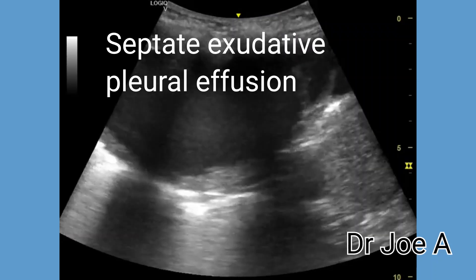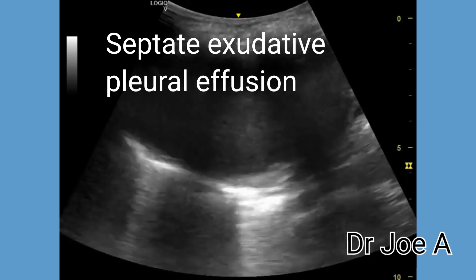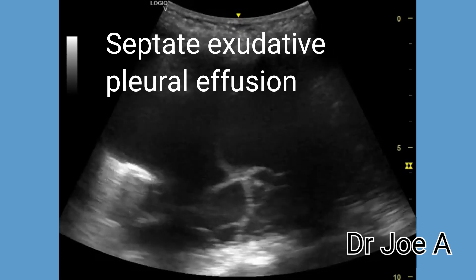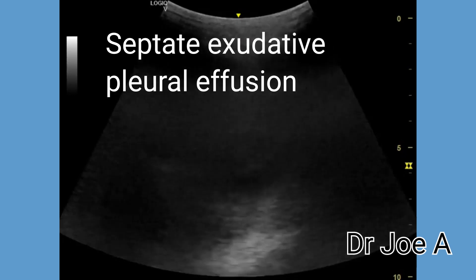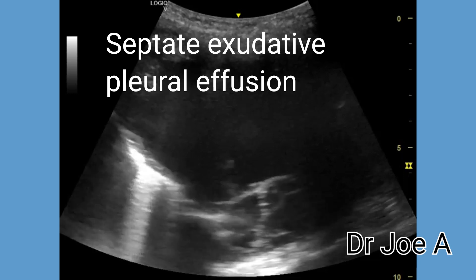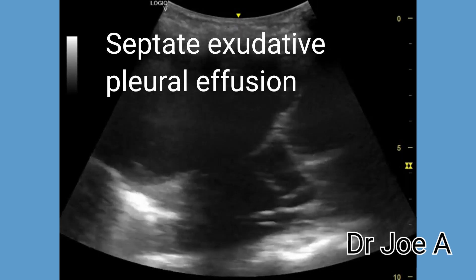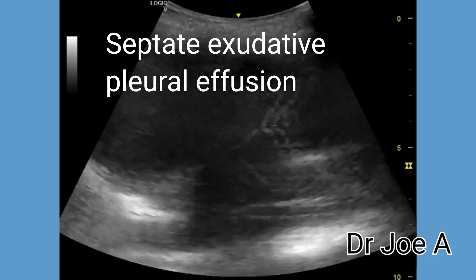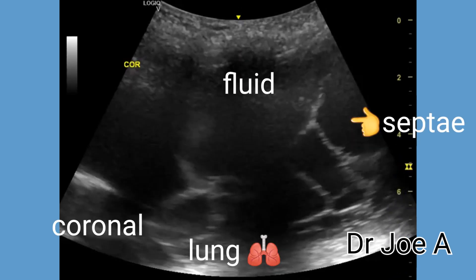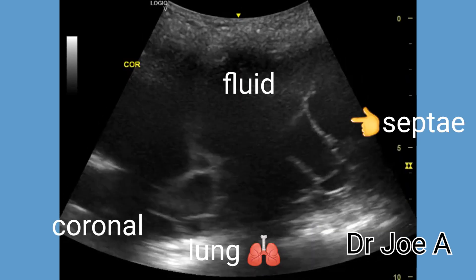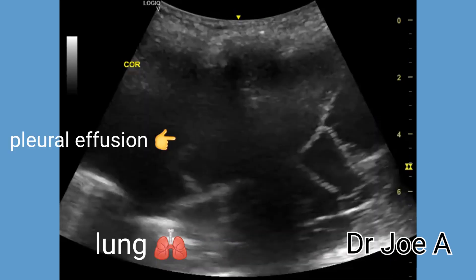This is a patient with a large left-sided exudative septate pleural effusion. The effusion appears to be measuring more than 15 cm long and up to 7 cm in depth. Multiple thin septae or loculations are present throughout the collection. The pleural effusion is seen as an anechoic collection between the chest wall and the lung, displacing the lung medially with multiple echogenic septations within the effusion.